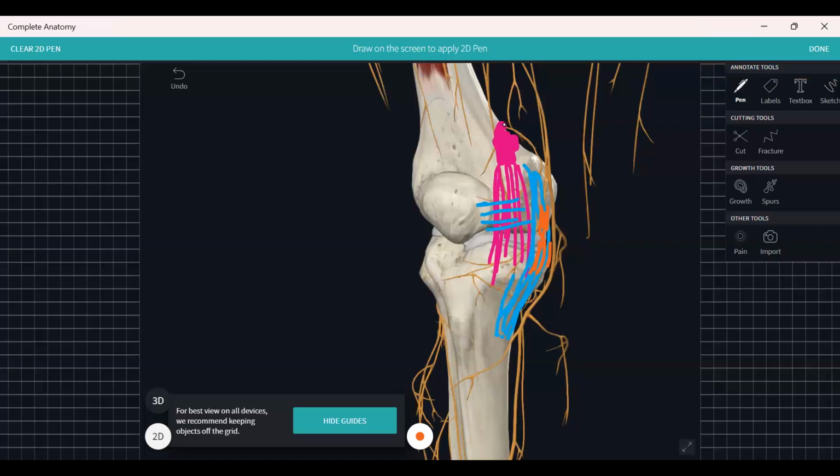Okay. Now, if you go to the lateral side, we have the same patellofemoral ligament, and above that is the lateral patellar retinaculum. This patellofemoral ligament is continuous with the lateral collateral ligament. Clear? The third layer is not there on the lateral side.